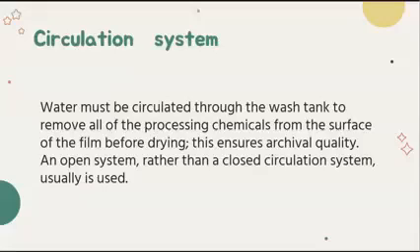For example, you sometimes see a fountain, where the water used overflows once it reaches the top, and then it is used again so the water is not wasted. But that's not the case for wash water, because once the water from the bottom reaches the upper surface, it goes directly to the sewer system. So that means it is used only one time. Okay, so once the water from the bottom reaches the upper surface, it is then discharged into the sewer system. So your water is used only once. Running fresh tap water is used for the wash tank.